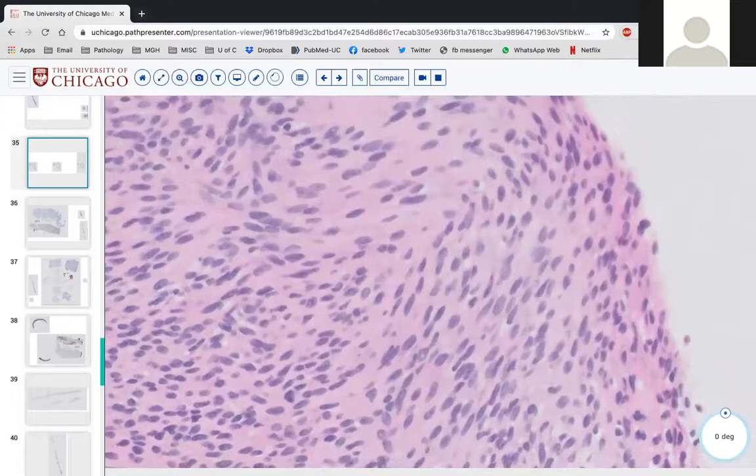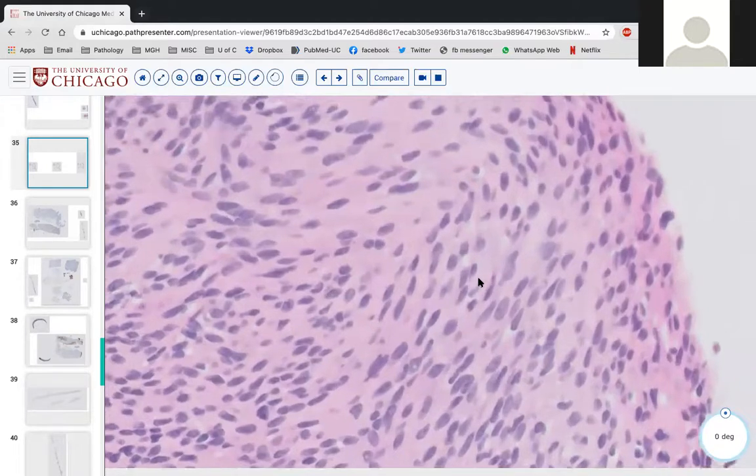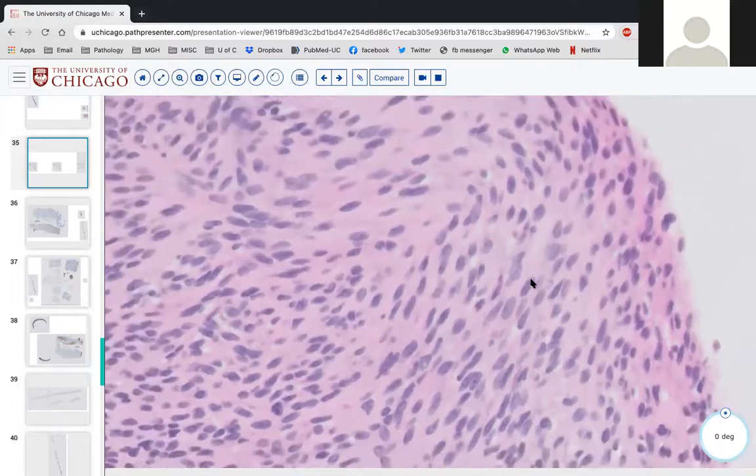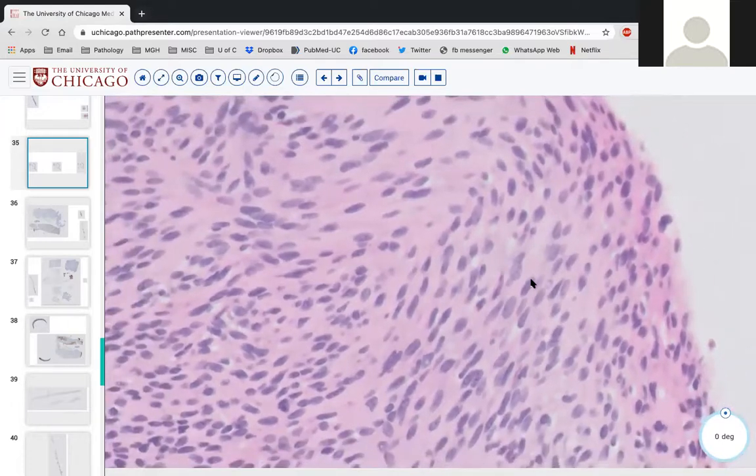For the history, it was a 38-year-old female with a 4.3 centimeter mass of the superficial lobe of the parotid extending into the deep parotid. So in terms of imaging and where they're taking this core, it's certainly within or directly adjacent to the parotid gland, but what would be your other thought if you don't think it's salivary primary? Right, something soft tissue, maybe smooth muscle in origin. Okay, maybe smooth muscle in origin.